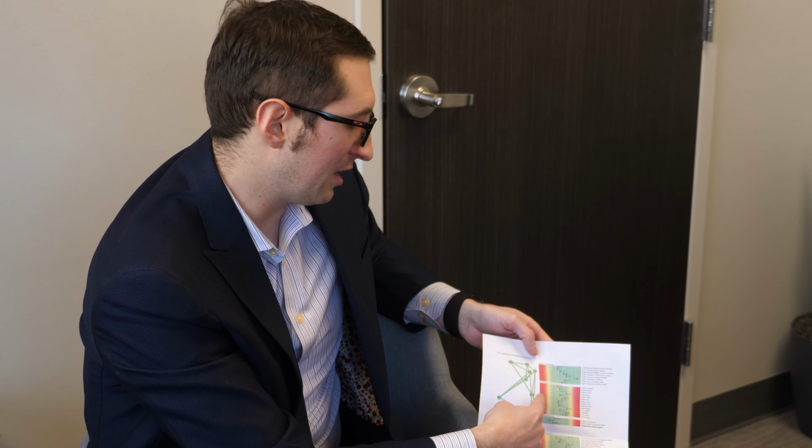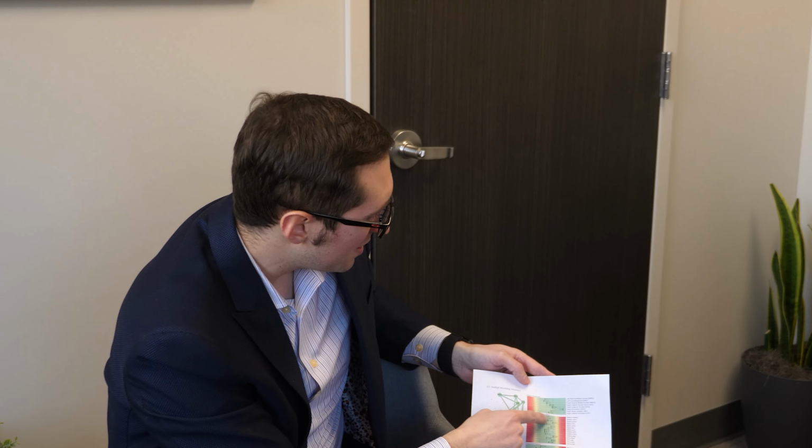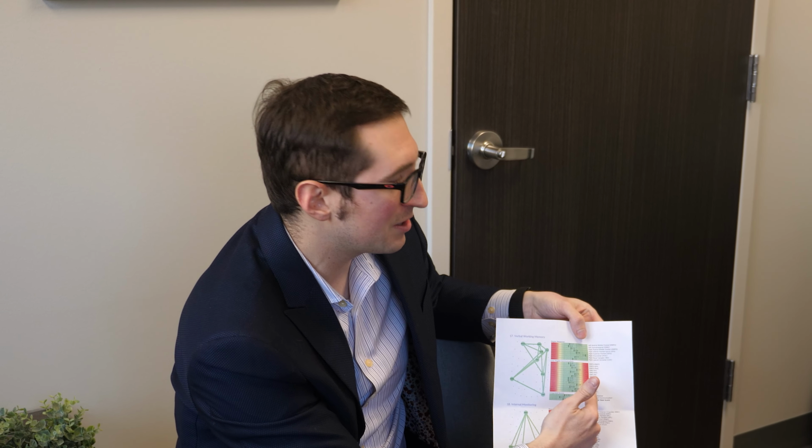So if we look at this, there's a stimulus, right? This test. We're looking at these regions that kind of communicate together, and this functional system works together. If you're over here on the left, this is that random, spontaneous activity, they're not connected. This green's nice. They're correlating together. But what happens if you give a stimulus and they are just locked in? They're communicating too much. That's over there to the left. I see. Oh, that makes a ton of sense.